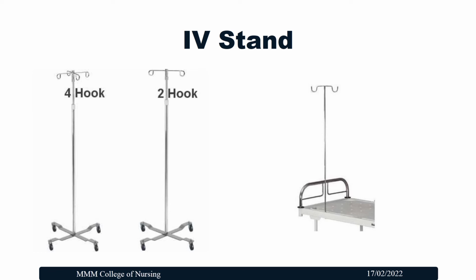IV stands are used to hang the IV bottles. It is available with a single hook, double hook and also with four hooks. It can come on wheels or it can be fixed directly with the cart also.